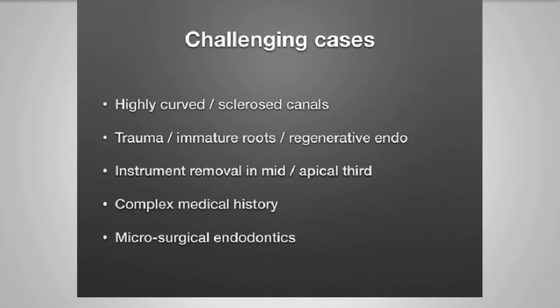Very highly curved canals, and you can sometimes spot this on a radiograph, or as we've seen earlier on in the presentation, very sclerosed canals. These are going to be much more difficult to manage, and certainly the use of fine files, recapitulation, and plenty of irrigation really helps in the management of those cases.